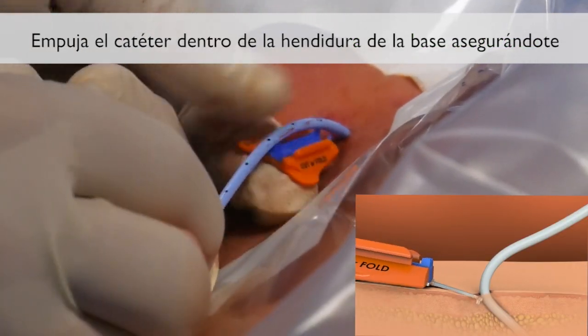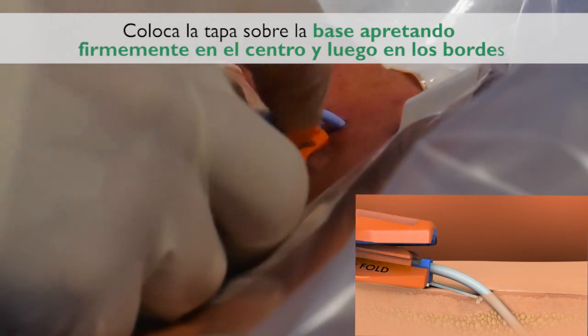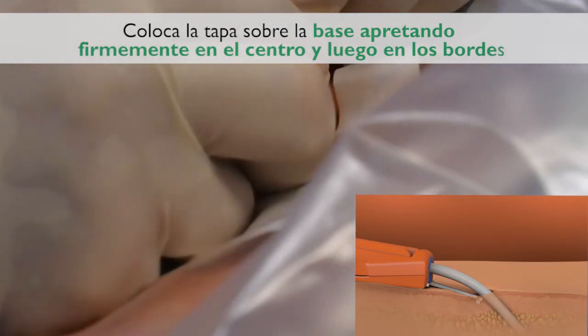Press the catheter into the groove and base, making sure the catheter shaft and SecuraCath base are dry. Place the cover on the base by pressing firmly on the center and then the edges.